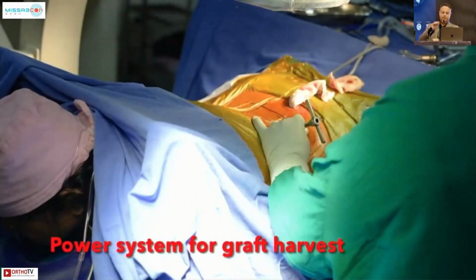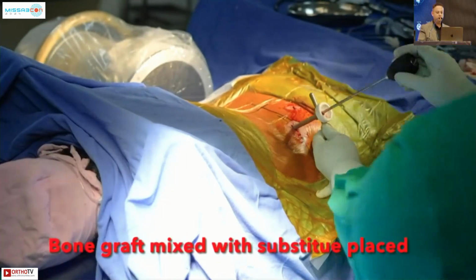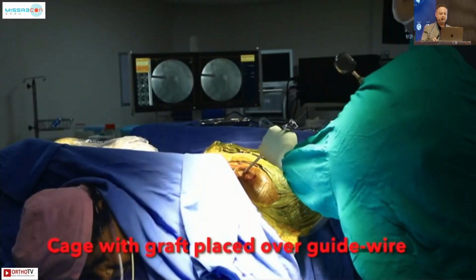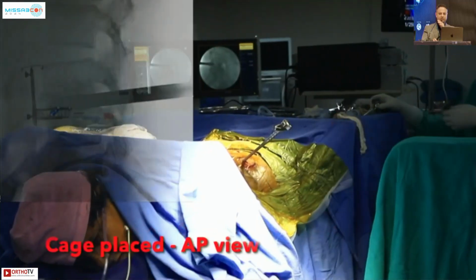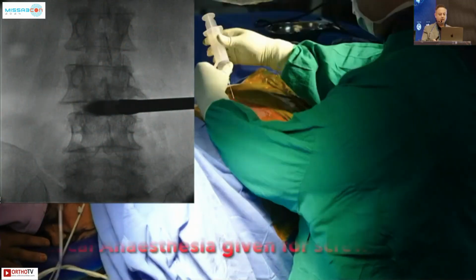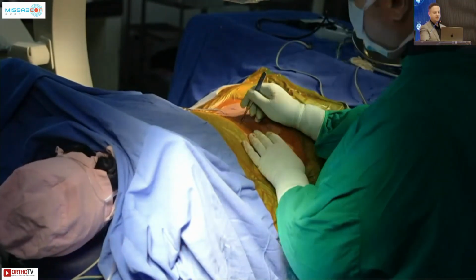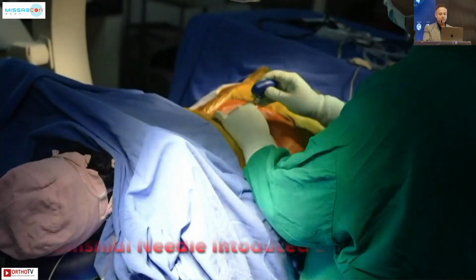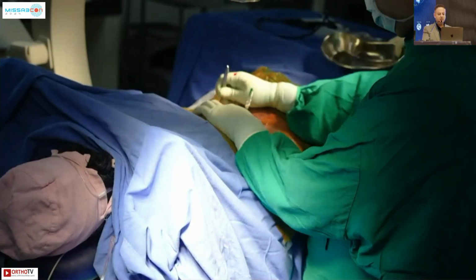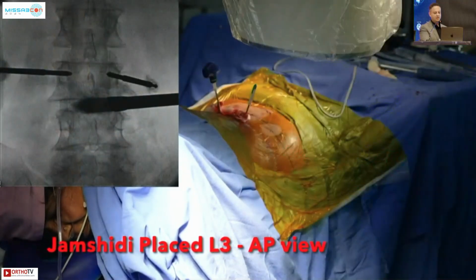And I prefer to use bone graft because my patients can't afford the biologics. And then finally the cage with the bone graft and some graft expanders is used. And this is all being done under local anesthesia, and you can see that the patient is awake and quite comfortable at that. And then again the Jamshedi needles, the regular way to put the percutaneous screws. Again you can see the patient is awake and under local anesthesia and quite comfortable.